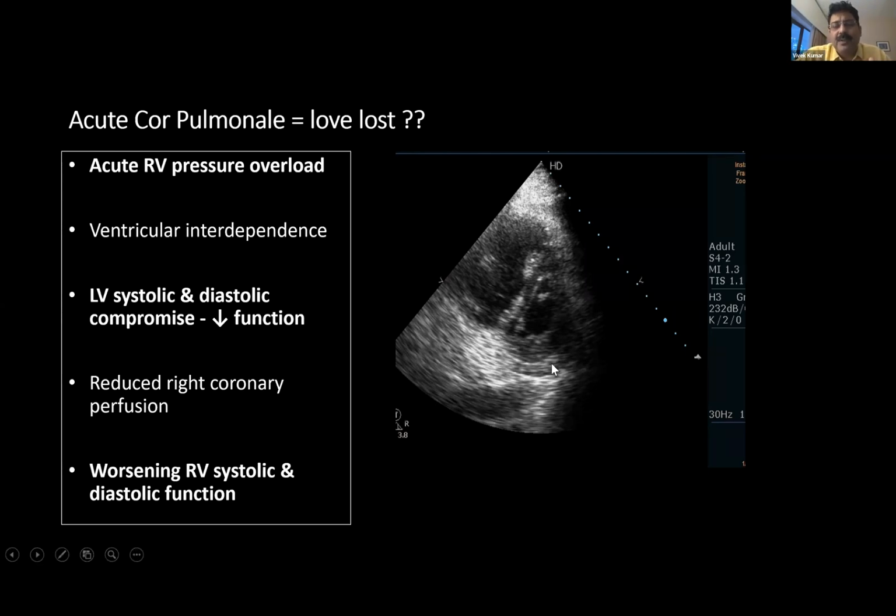Similarly, this stress is also evident on the interventricular septum, which gets pushed into the LV. The moment the interventricular septum is pushed into the LV, the size of the LV cavity becomes small. I agree that the push is most prominent in end systole, but it is also present to some extent in mid systole, and the right ventricular pressures can exceed the LV pressures initially in systole and later in diastole.